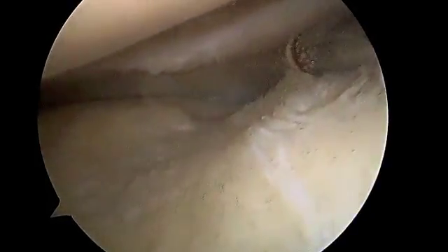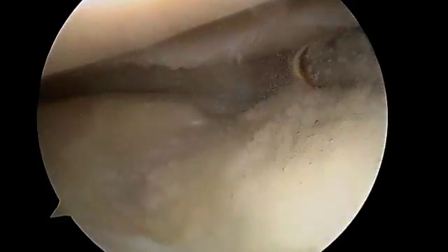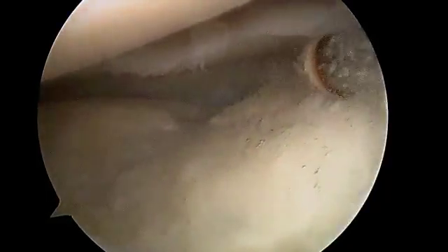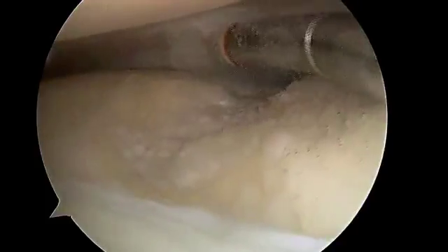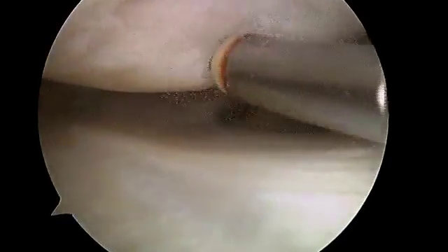So we're going to do the same thing — we're going to get the non-aggressive full radius shaver, just use the edge of it to get the unstable part. I want to leave the articular cartilage that's not damaged alone, but I do want to stabilize that and prevent it from breaking off. This is a radiofrequency probe. It uses a very controlled measure of energy to coagulate the unstable cartilage, and we're going to seal the edge to prevent any additional loss of articular cartilage.